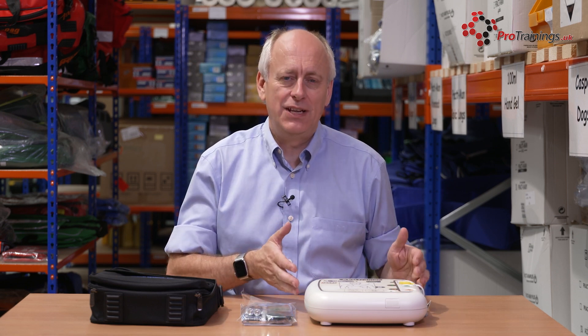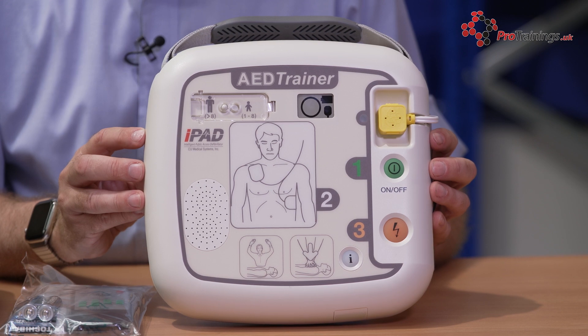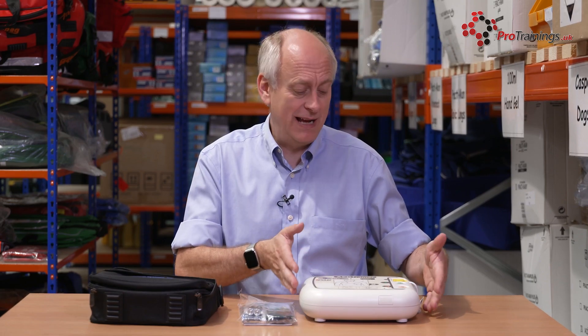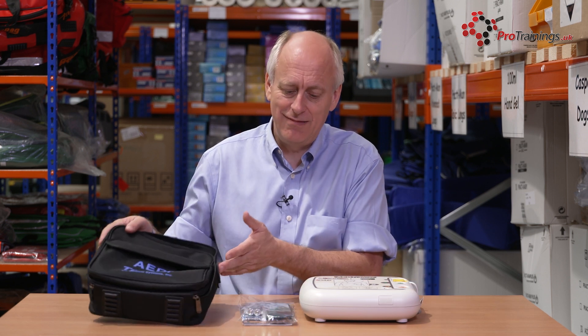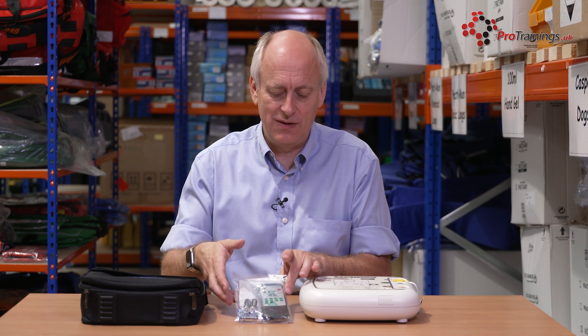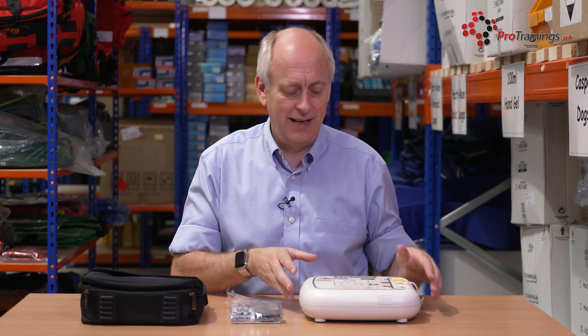We're now going to look at the iPad AED Trainer — it's a good one for use in training, and it does simulate the live unit. The AED comes as itself, the main unit, and the pads are already pre-assembled. It has a carry case and also a pack with the remote control and the batteries in there as well, so everything you need to get started is included.